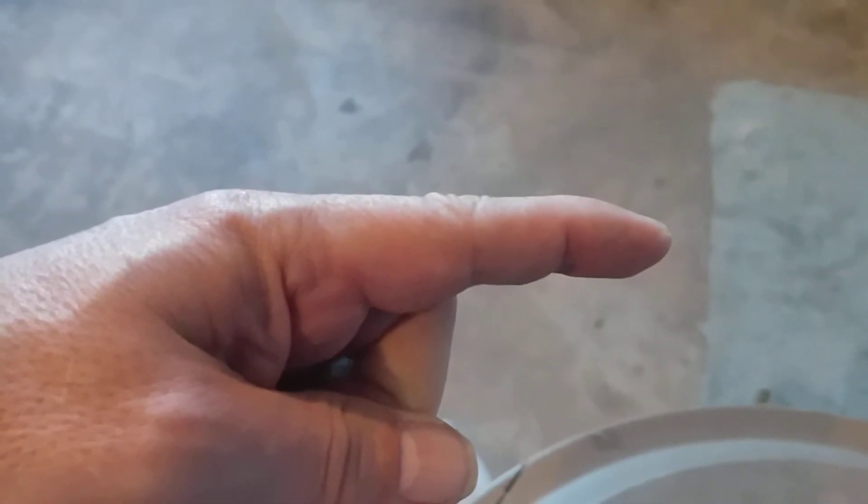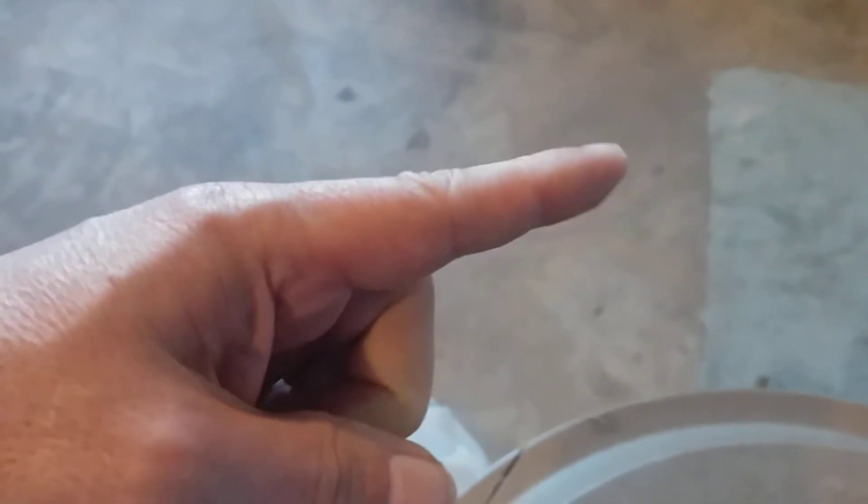You've got a little bit of mallet finger when you're out playing. Fingers get jammed. I don't want to say it's not bad, but fingers bent down like that.